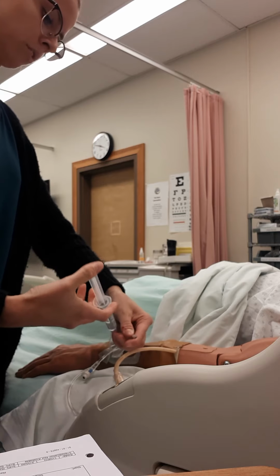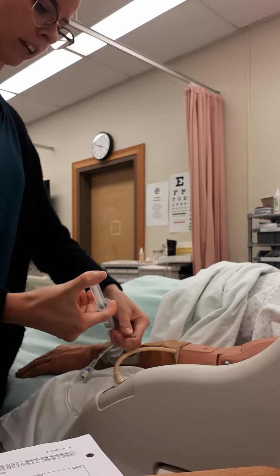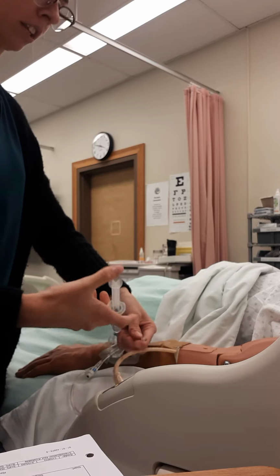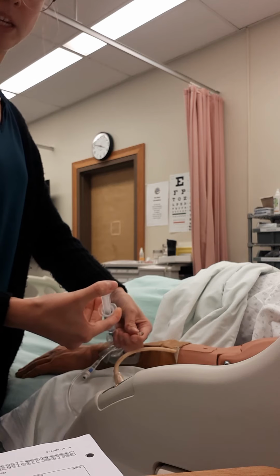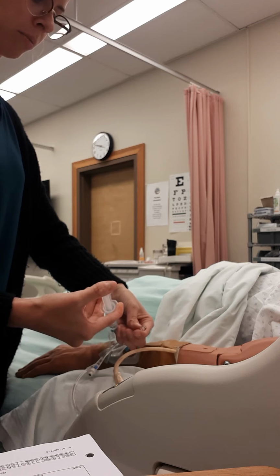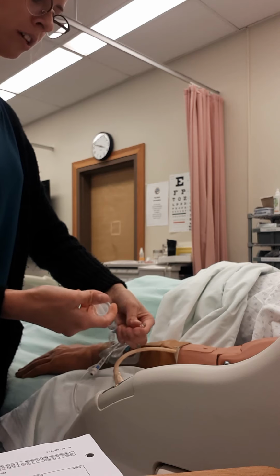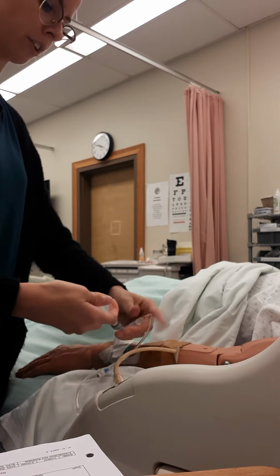And I'm going to do, at the same rate, over 30 seconds of giving her the normal saline to flush the medication all through. So again, speeding it up for the video. And then I'm going to push, pause, push, pause, push, and clamp under pressure.